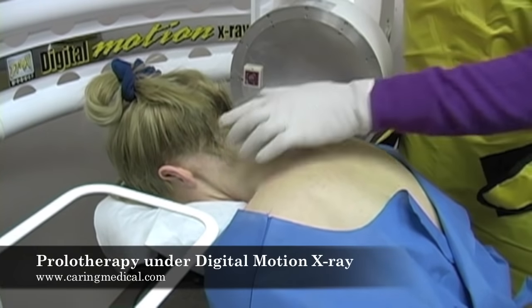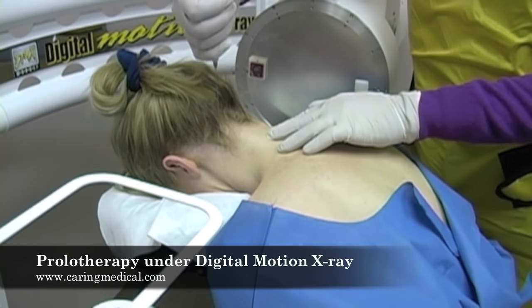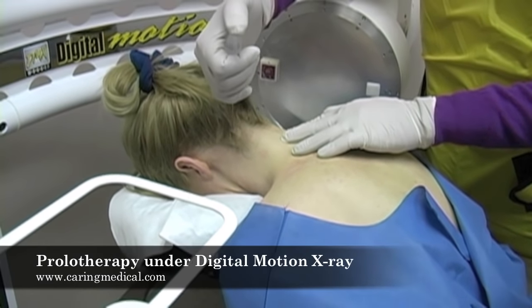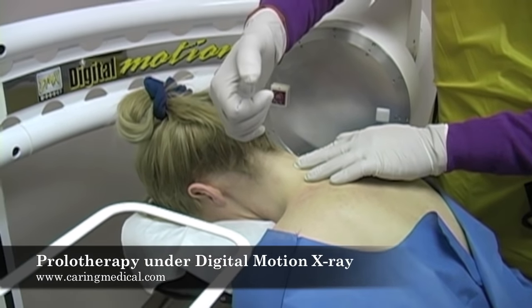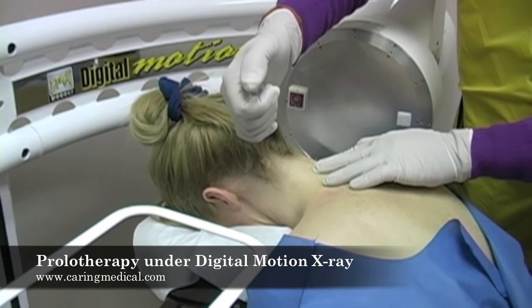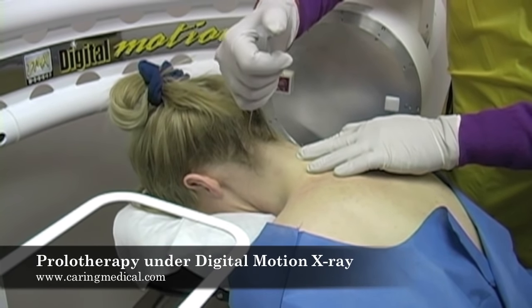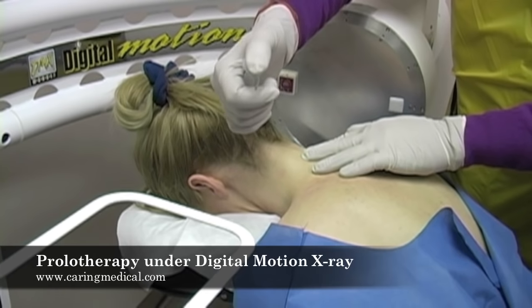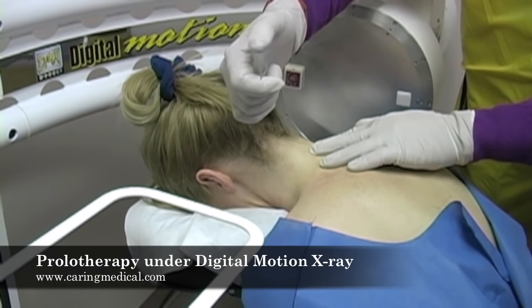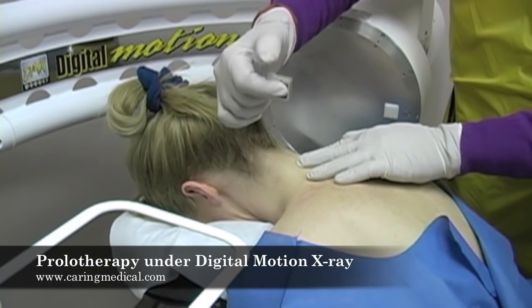One of the technologies that we use at Caring Medical is called digital motion x-ray. Digital motion x-ray is a great method to document cervical instability. It's actually a fluoroscopic x-ray that is taken while the patient moves their neck.